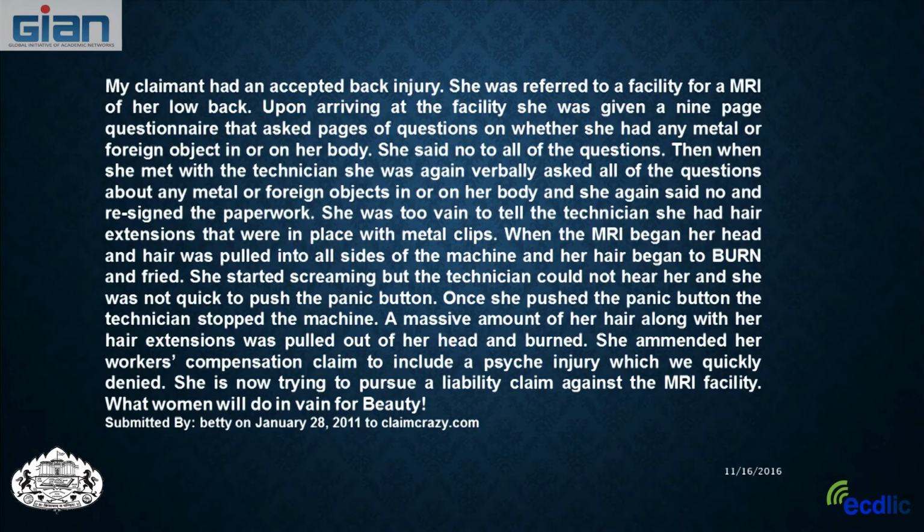But we've also had cases of elderly people who had wigs on, and they're too embarrassed to say that they're wearing a wig. And we had one case where we had got the lady into the machine, and there was a big black artifact all around her head, and it was due to this wig that she had on. So even things like this that you may not consider should be thought about before we go into the magnet room.